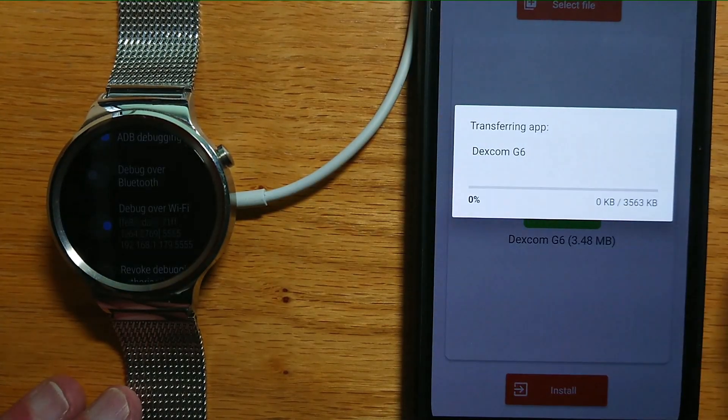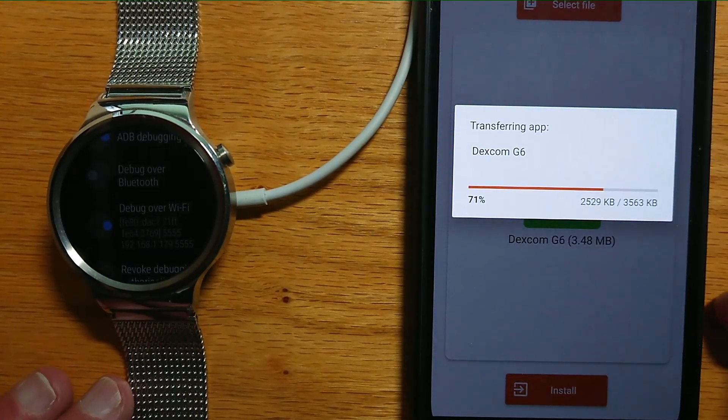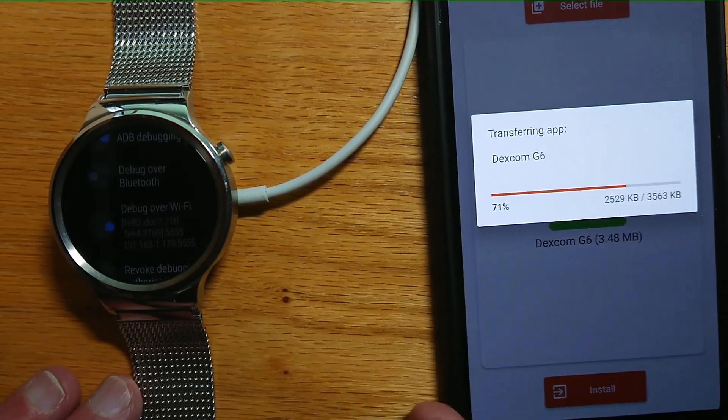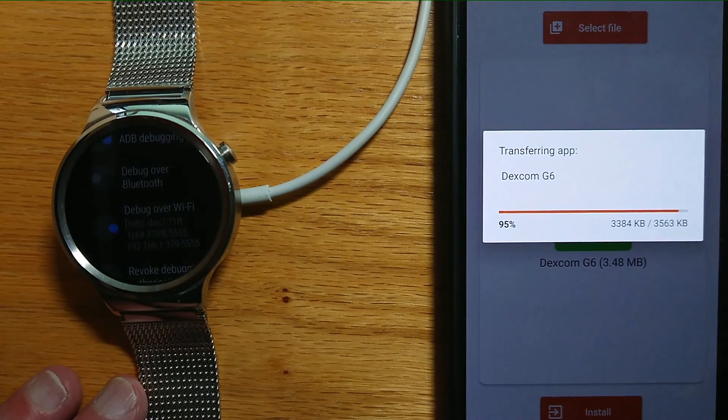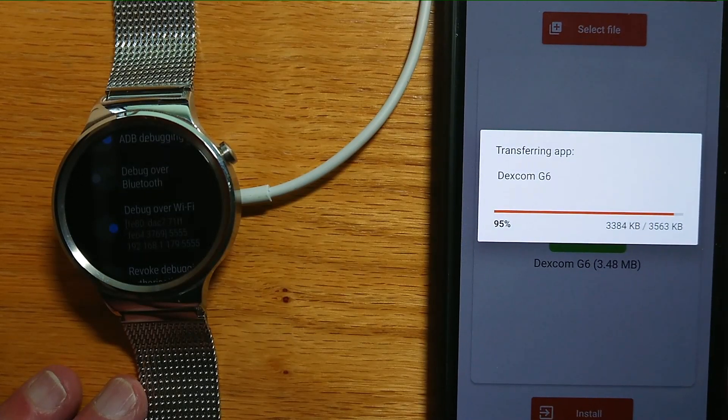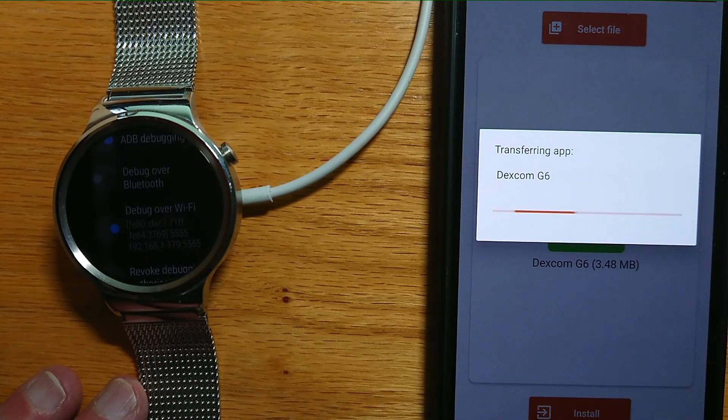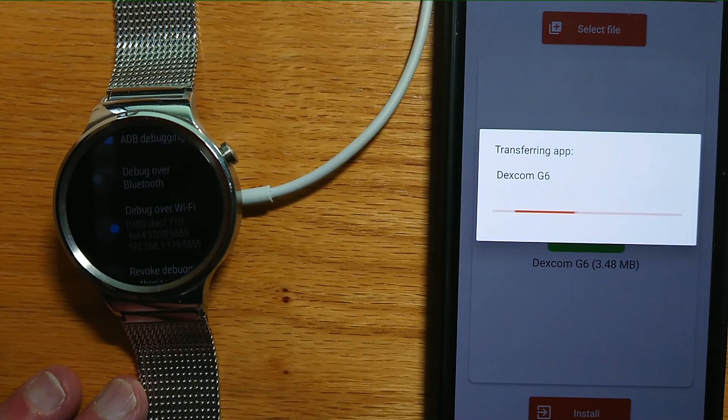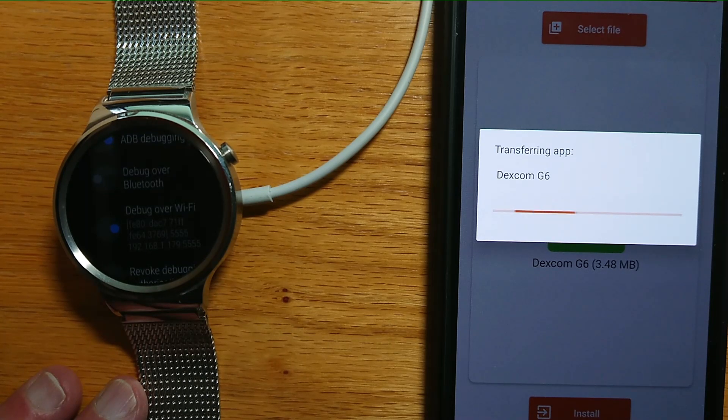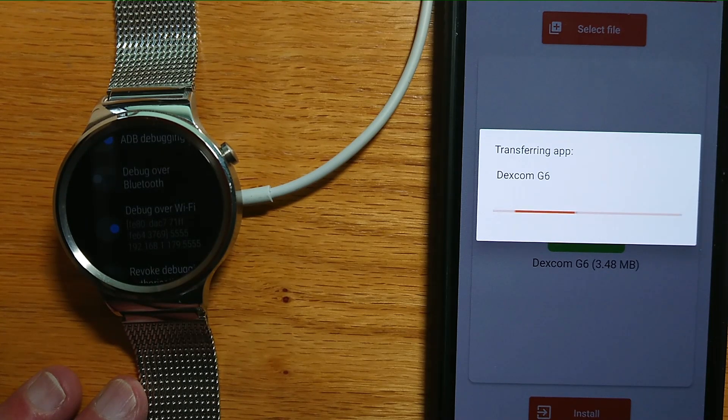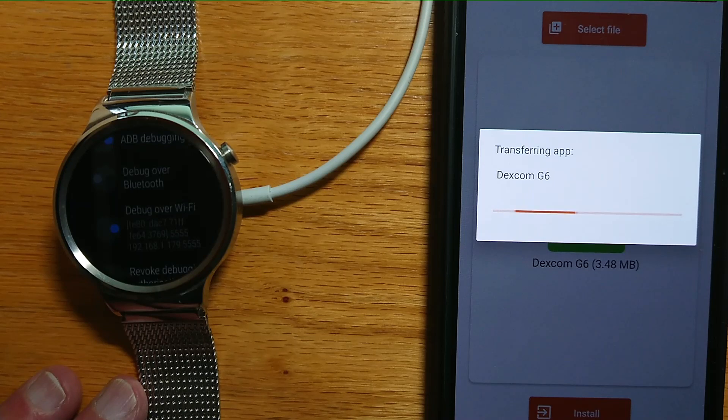Yes. Now Easy Fire Tools is going to transfer the app from the phone to the watch, and this is going to take just a little bit of time, and we'll have to be patient.